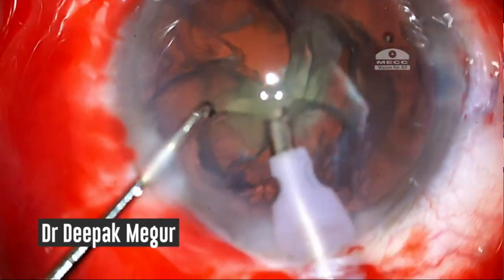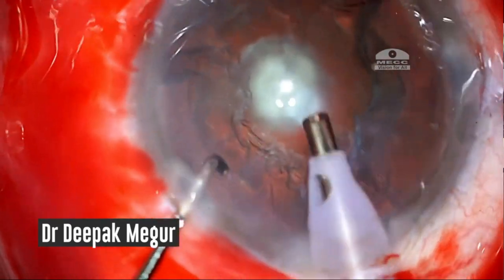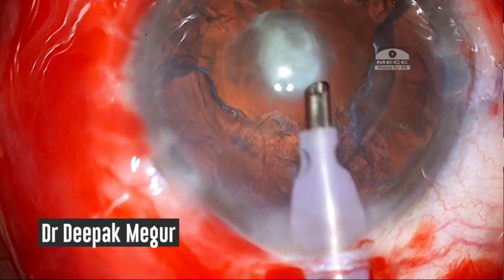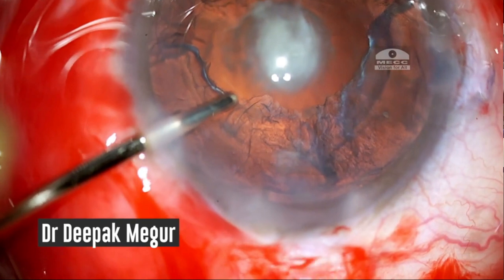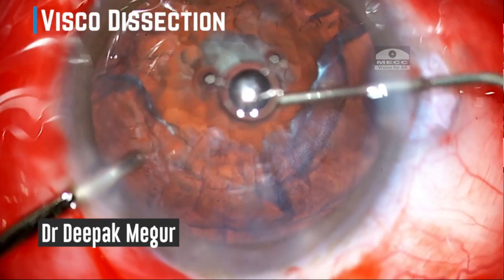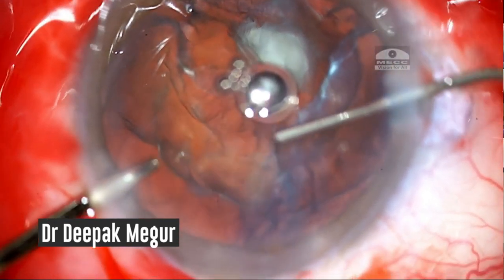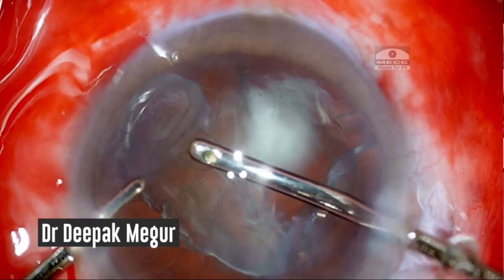Now I'm trying to engage the epinucleus and consume it, but the small size of the rhexis is restricting the easy accessibility of this epinucleus. Once I've trimmed the distal part of the epinucleus, before removing my phaco handpiece, to prevent the AC from shallowing, I'm introducing another handpiece with irrigating fluid so that the chamber is maintained throughout. Now I'm using dispersive OVD. The idea is to perform visco dissection so that the epinucleus is pushed into the pupillary plane. And at the same time, the dispersive OVD also provides a sort of a barrier and a tamponading effect for the posterior capsular tear, which is presumably present behind.